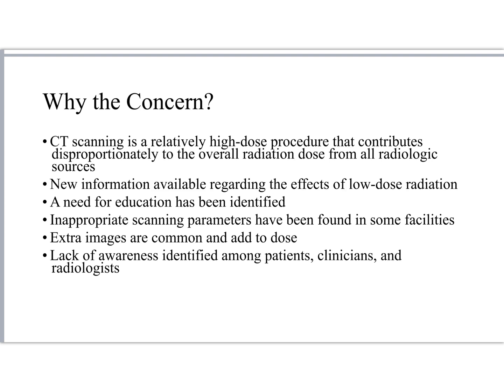So we need to continue to put forward research. It would be wonderful if we had a database where we could house information about people's radiation exposure and keep records over their lifetime, so we could know a little more about the low dose radiation exposures that we generally use in medicine. There's definitely a need for education, and when I say education, I'm not just talking about educating our patients. I mean educating our fellow techs, educating physicians who are ordering. There's even a need for educating radiologists, because they don't necessarily understand all that our scanners are capable of. And so sharing information is good.